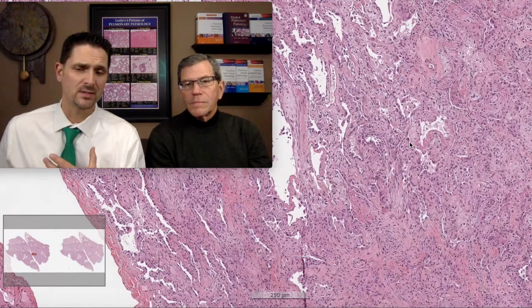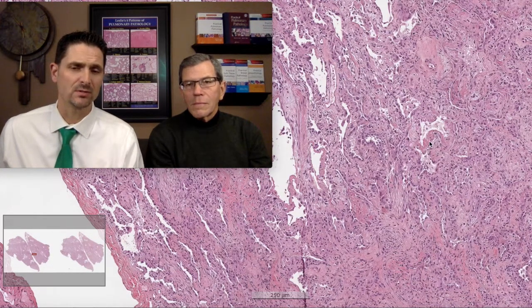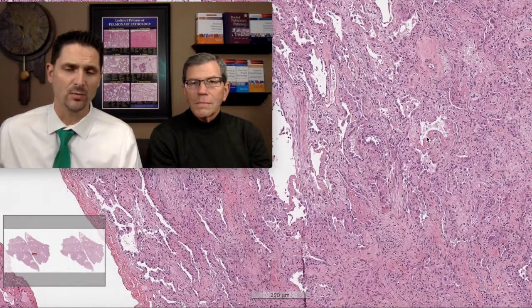B: blood. Remember that a vasculitic process — pulmonary vasculitis — will have acute lung injury as part of the presentation. So if you have acute lung injury and you're seeing hemosiderin-laden macrophages, or fresh red blood cells caught up within the fibrin, then that acute lung injury is likely due to an acute and organizing alveolar hemorrhage process as opposed to being idiopathic.